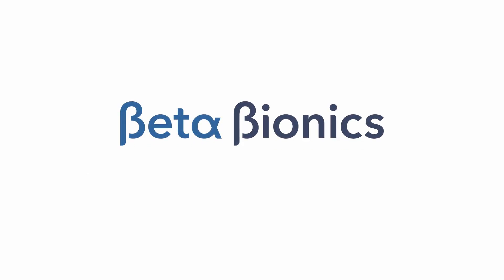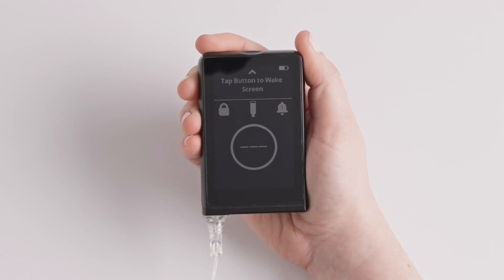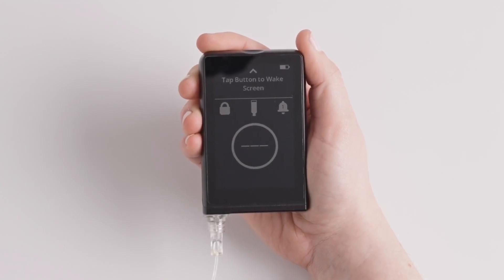Your islet is compatible with the Dexcom G6 and the Dexcom G7 sensors. You can switch the type of sensor you are using in the CGM menu.